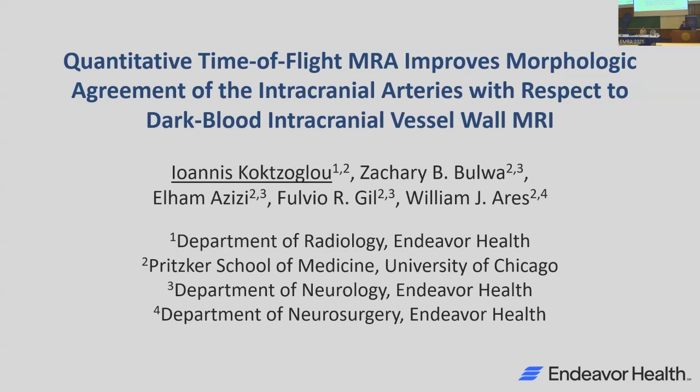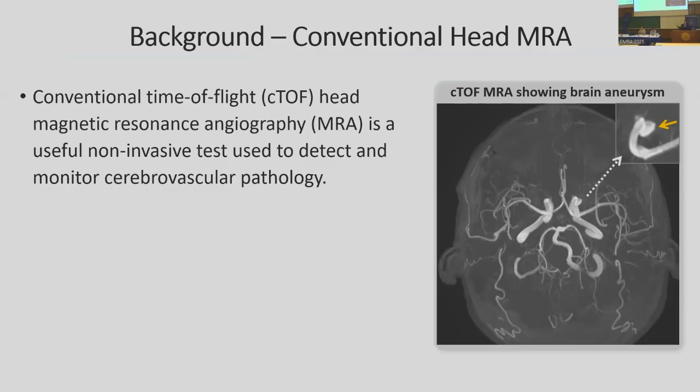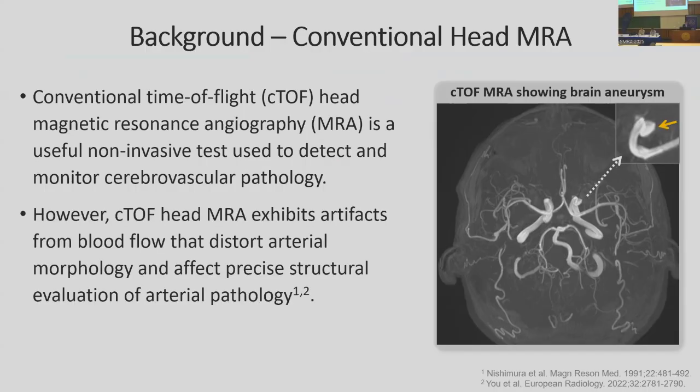Thank you, Dr. Musabasha, for the introduction. It's a pleasure to be here and be able to share our work. So I think, as many of you are aware, conventional time of flight head MRA is a very useful test that's often applied clinically to either detect pathology, but also to monitor it over time.